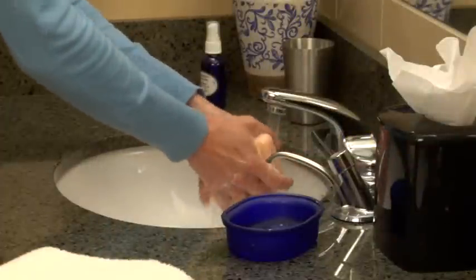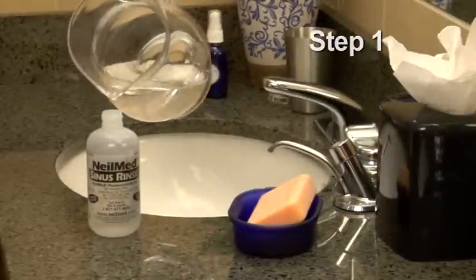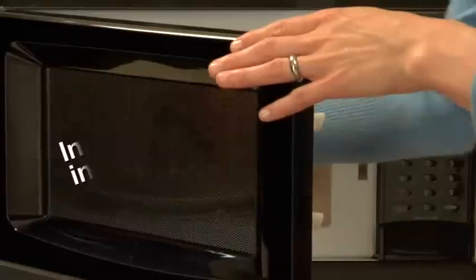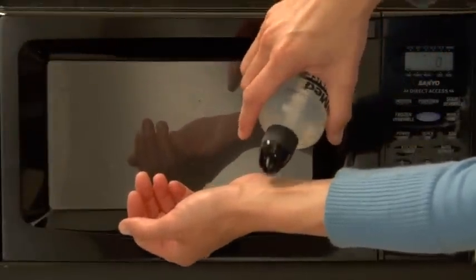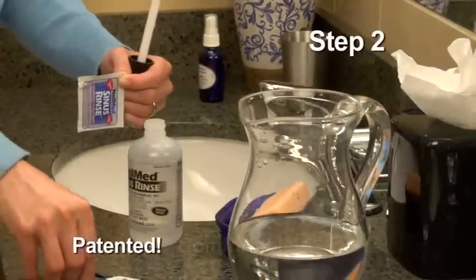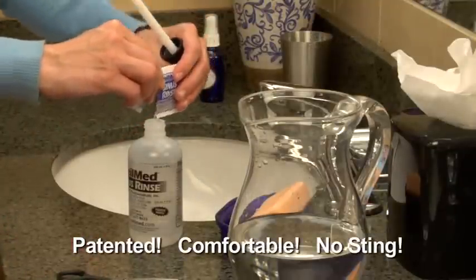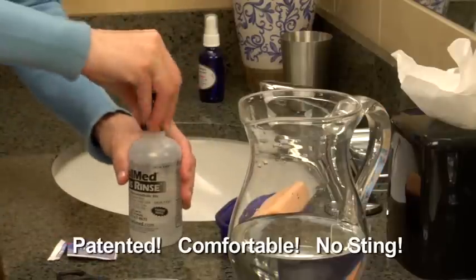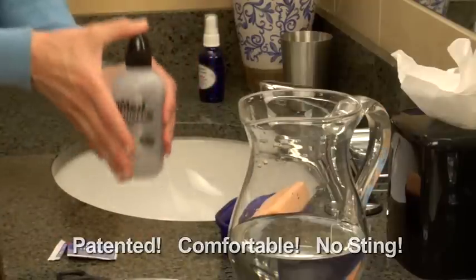First, be sure to wash your hands well. Fill the pot with 8 ounces of warm distilled water or previously boiled water. It's okay to warm the water in a microwave, but you don't want the water to get too hot. Next, cut the corner of the sinus rinse mixture packet and pour its contents into the bottle. Make sure you tighten the cap and tube on the bottle firmly, put one finger on the tip of the cap and shake the bottle gently to dissolve the mixture.